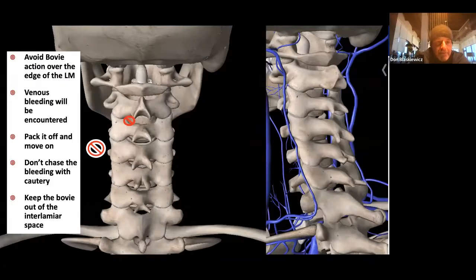One important consideration in the training setting: as you're running the bovie it may get over the lateral edge of the lateral mass, and there's a lot of venous bleeding. The instinct is to put more heat on it with the bovie or bipolar, but that doesn't stop it — there are rich veins and plexuses over the side of the lateral mass. The best approach is to pack it off with Surgicel and a cottonoid and come back to it later. It usually stops on its own. Also, be very respectful of staying out of the interlaminar space with instruments and bovies.